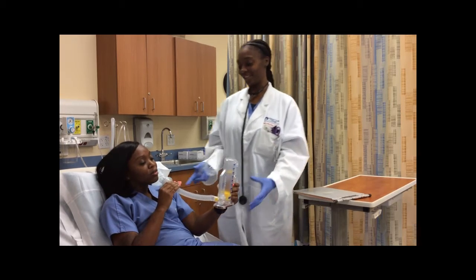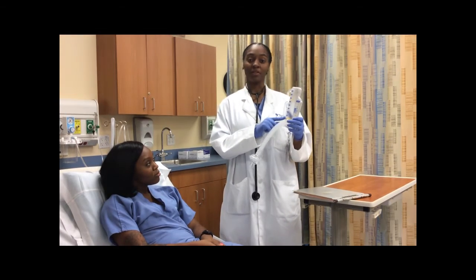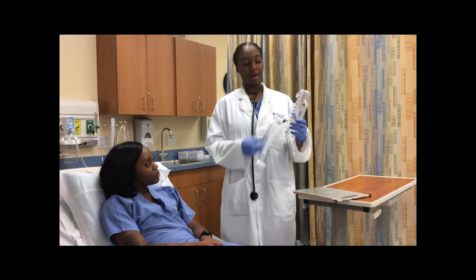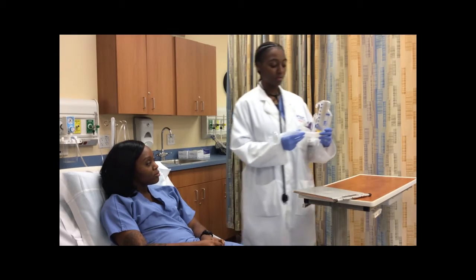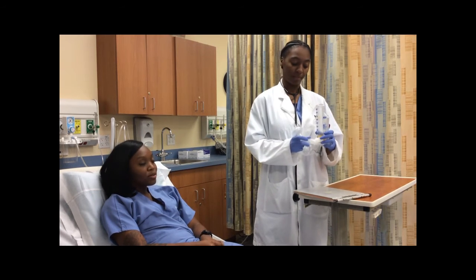Good job, good job. The patient wasn't able to reach her target volume at first, but you're going to do this every hour for 6 to 10 times. Then by then you should be able to reach your target volume. I'm going to place this at your bedside in reach so you can continue to practice, okay?